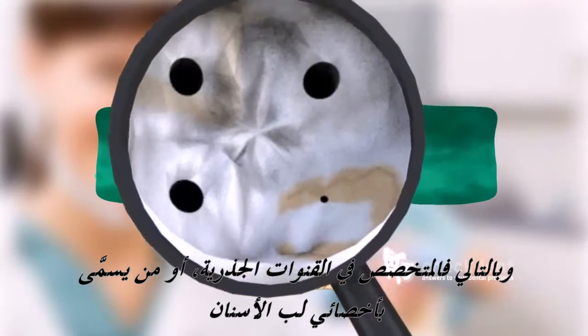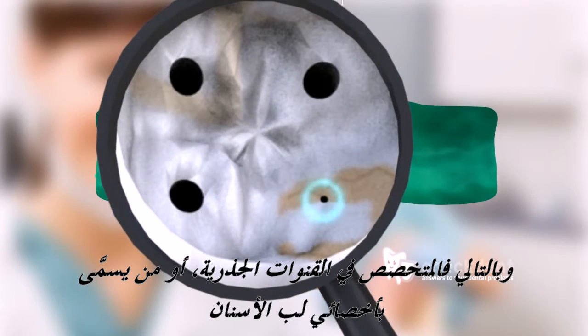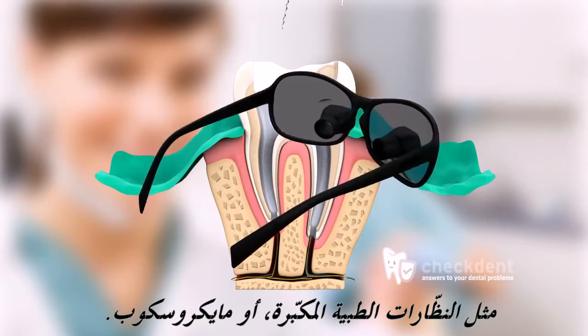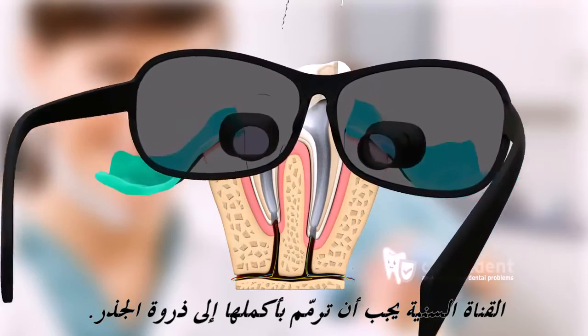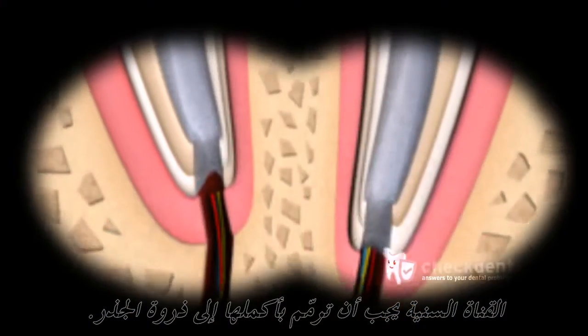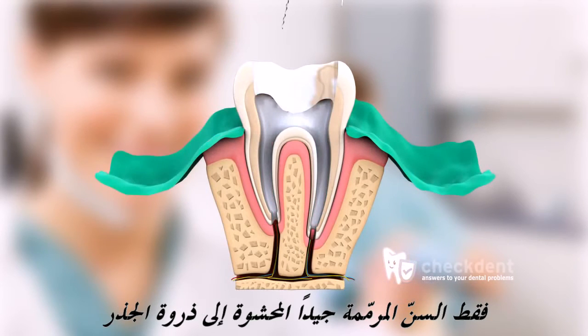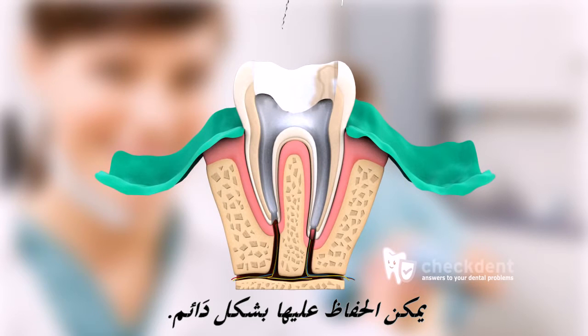Therefore, a root canal specialist, a so-called endodontic specialist, always works with magnification, such as medical magnifying glasses or a microscope. The dental canal must be reconditioned all the way to the root apex. The length of the root is ascertained by means of X-rays and measuring aids. Only a well-conditioned tooth filled all the way to the root apex can be preserved permanently.